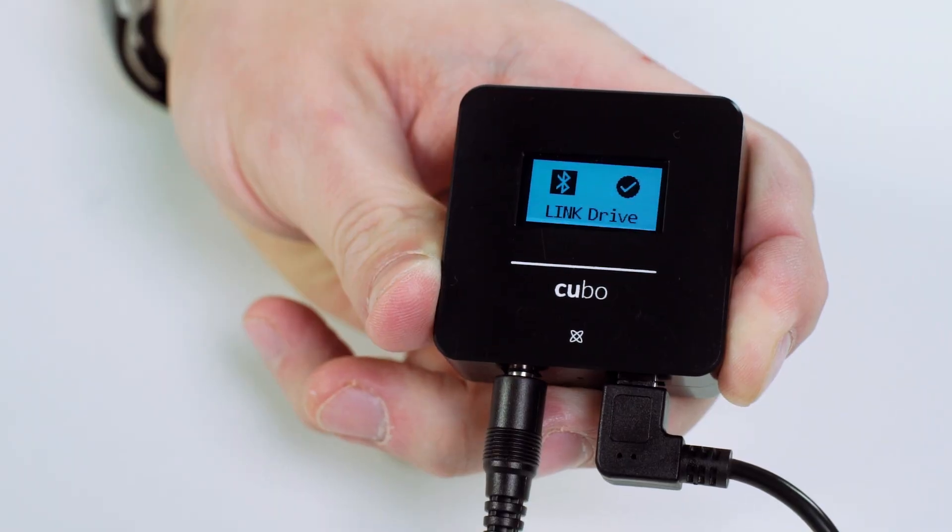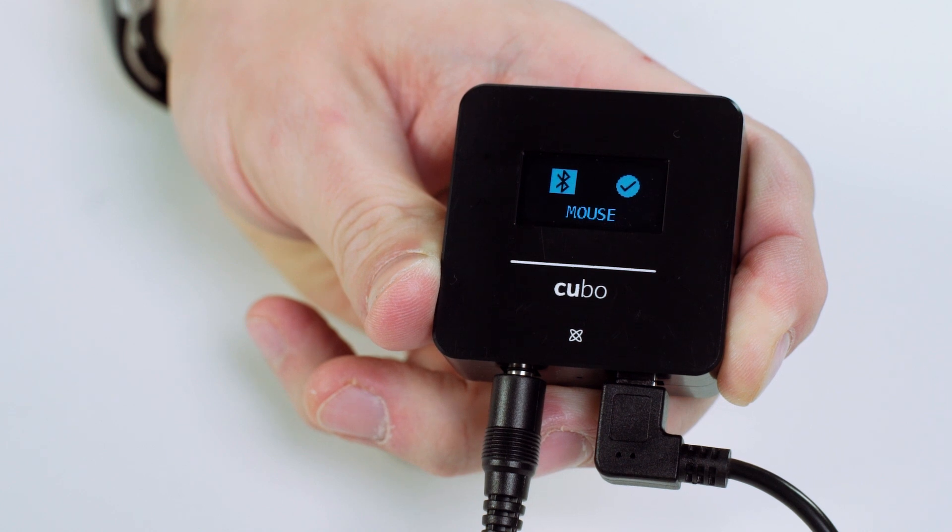If you have a VEGO drive kit, long press the headrest sensor or the external switch for around a second until the Cubo screen illuminates, then release the headrest sensor. You should see 'mouse' displayed on the screen. Then you can activate and deactivate the mouse with a short tap to the headrest sensor or auxiliary switch, exactly how you would for driving.